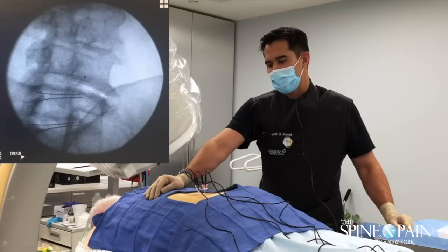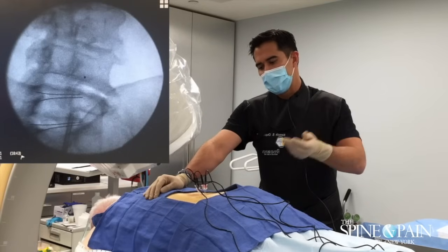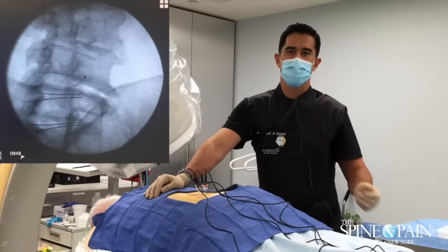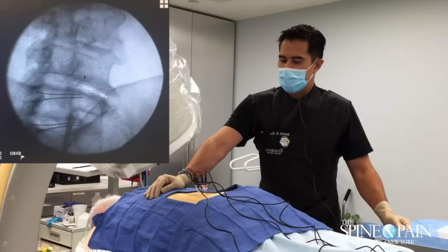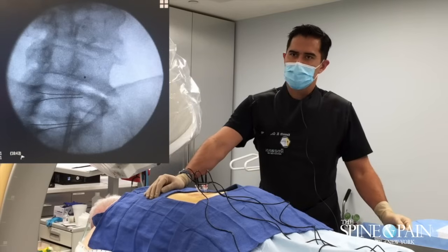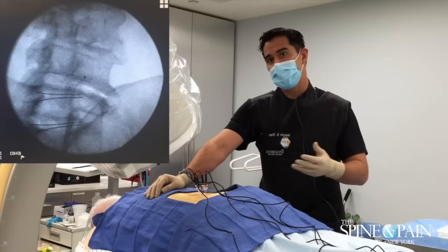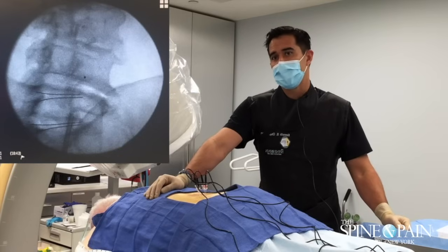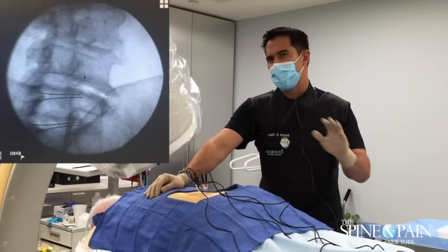Unfortunately, although it destroys the nerves, part of the sheath that they lie in is still there. So somewhere from six to nine months, this nerve can grow back and the pain can return. Some patients also have multiple reasons to have pain. In this case, I wouldn't be surprised if he has some pain related to that disc degeneration and that bony involvement he has going on.